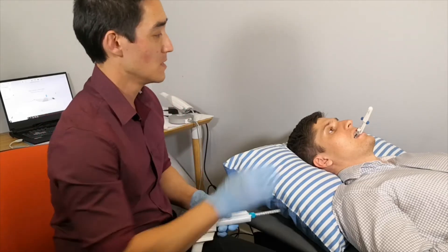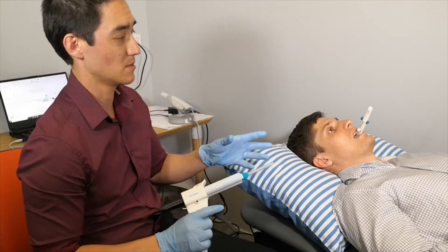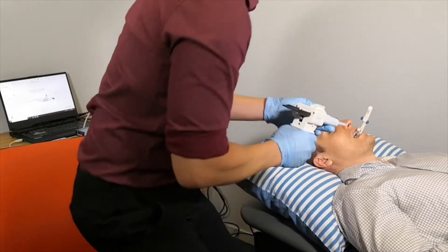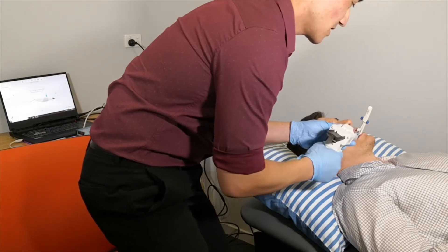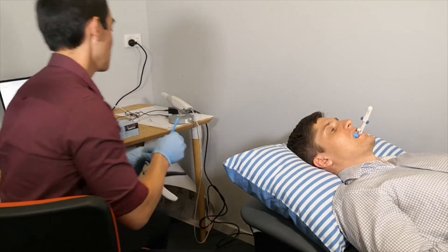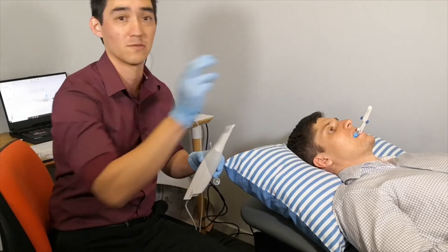Or we can actually do it a little bit more simply. I know his midline is absolutely perfect — I've already checked it. So now we can actually use a bit of bite registration just on the anteriors, as that will still lock in the molar areas and there will be no bite registration in that area that will impede the scan. So just a little bit of bite registration impression material mainly from the canines forward — do it on both sides. That takes, depending on your bite, maybe 10, 15, 20 seconds. Now once this is set, we can actually scan it straight in so that the lab will know exactly where to start.